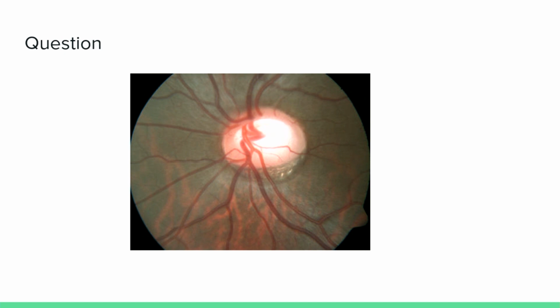Yes. See the difference? Yeah, it's more well defined, the superior disc margin, as compared to the inferior. So there's an inferior slope. Is that what you're saying? No. Why is it a tilted disc, sir? How many of you would say that it is tilted inferiorly slightly? It's difficult to say that. Could be a slope or it could be some tilt also there.